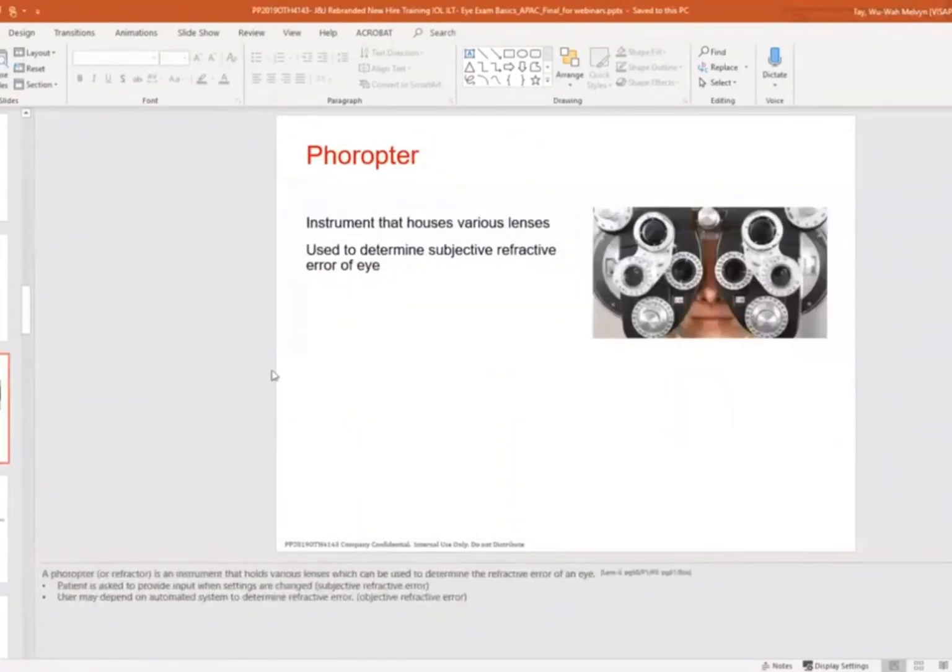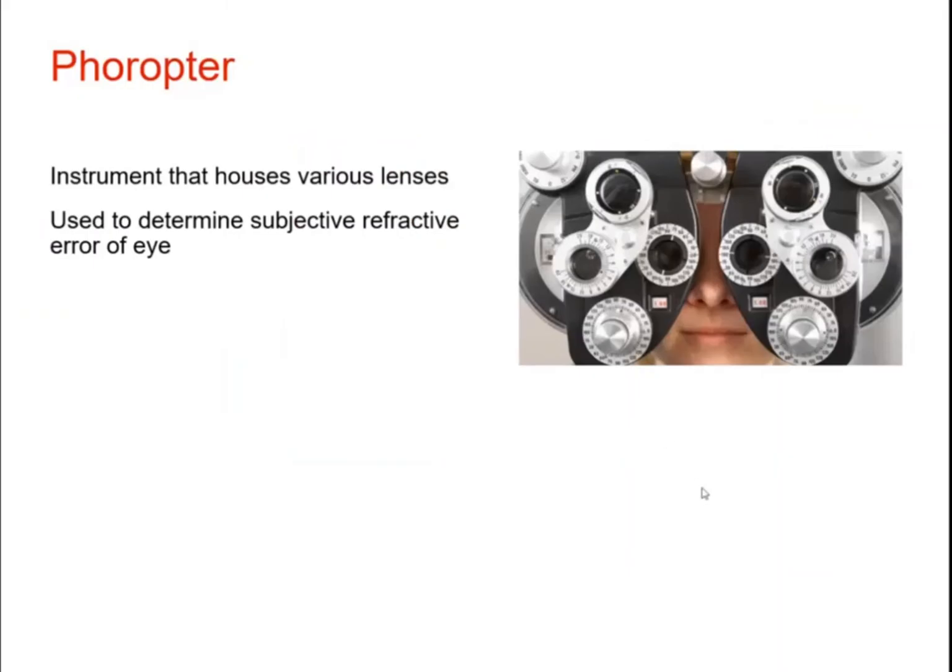Yeah. So that's objective measurement of refraction. And of course, there is also the subjective measurement. Subjective measurement requires you to use either a Phoropter or trial lens. This requires the use of the instrument together with the Snellen chart. So the patient needs to be able to see 20/20 on the Snellen chart to determine that the correction is up to emmetropia, right?